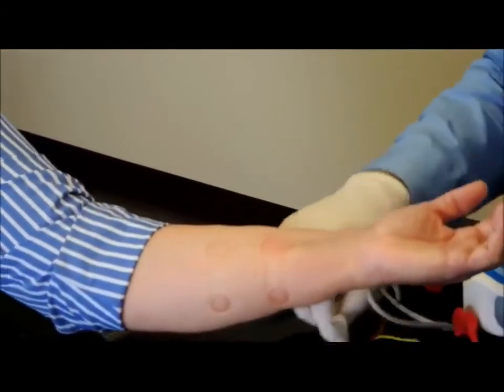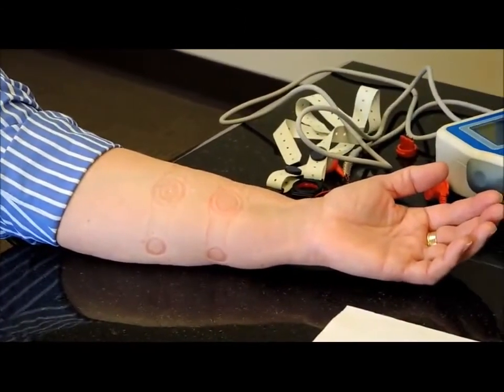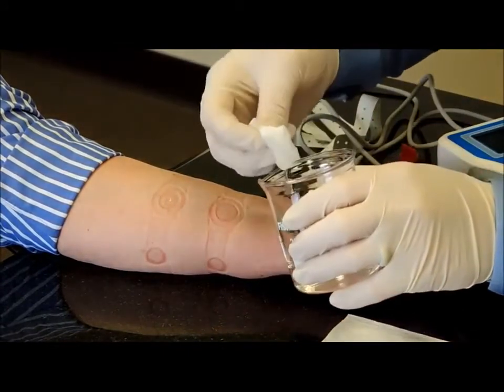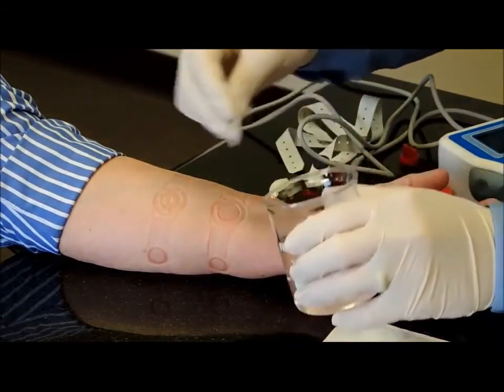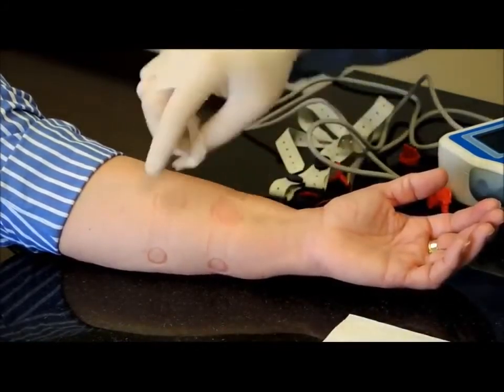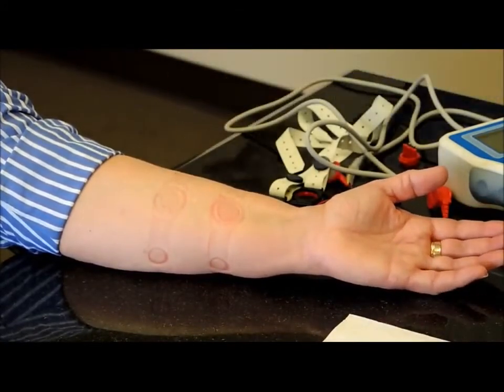Okay, and now you'll see there's a little bit of liquid left over, so we'll just wipe that off for the patient so that they don't have any worry about it. So again, a little Kim wipe and some water, just wipe that off. Their skin will be indented like that. The indent seems to go away in about a day.